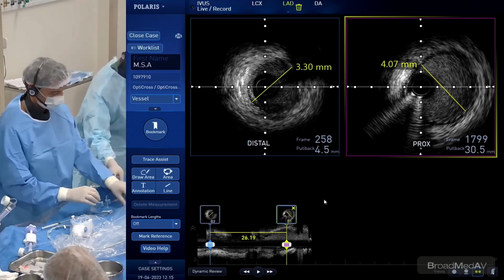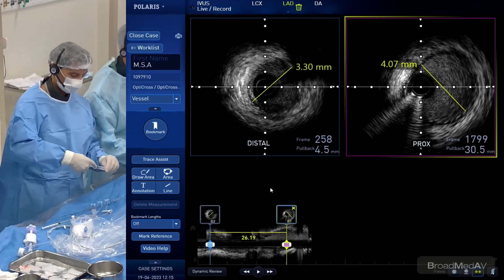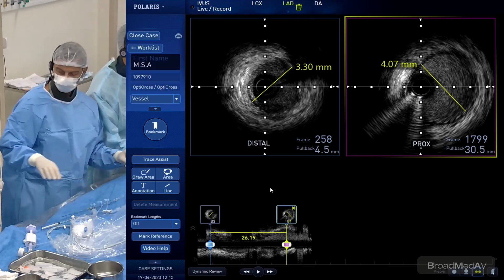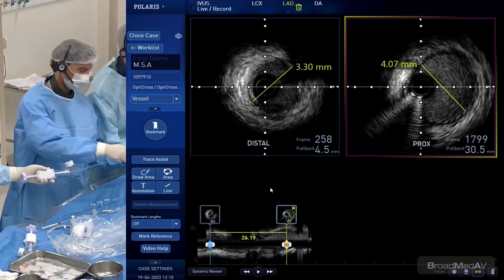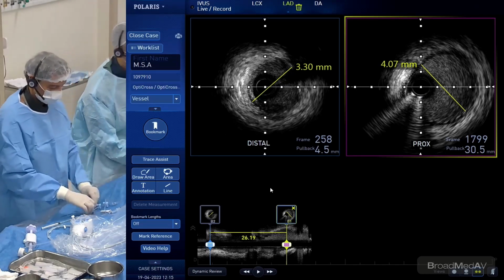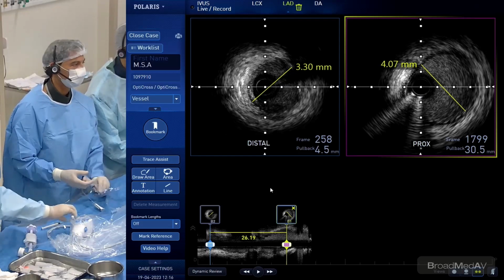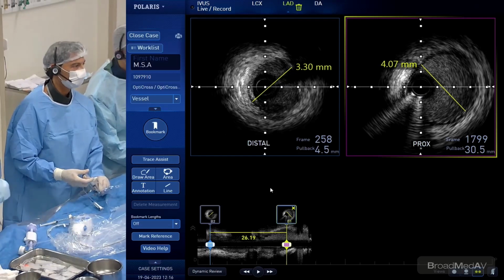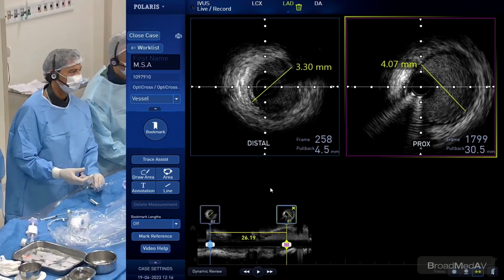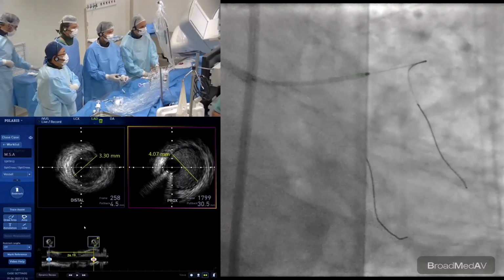Let me ask the operators while you're working. Luis Nakayama and our youngest staff here at the table. Would you use IVUS for pre-evaluation, or would you just go with the stent? I think we are trained to use only the angio. We feel comfortable to do that. How about you, Rodolfo?